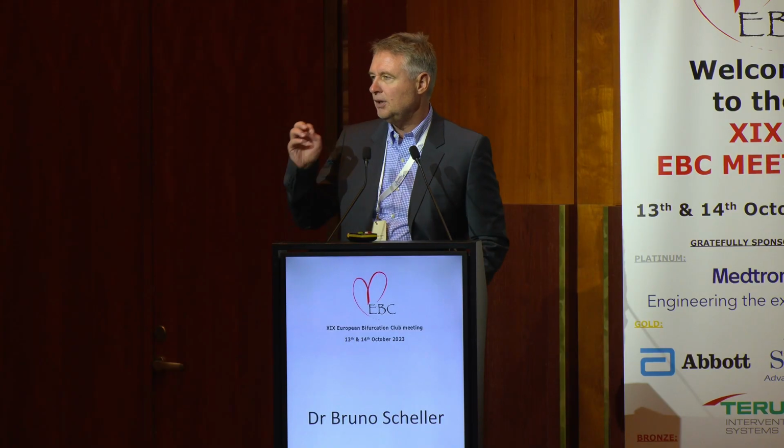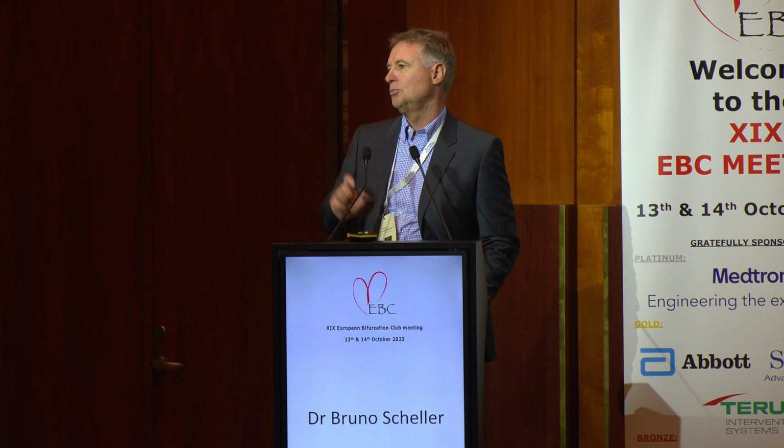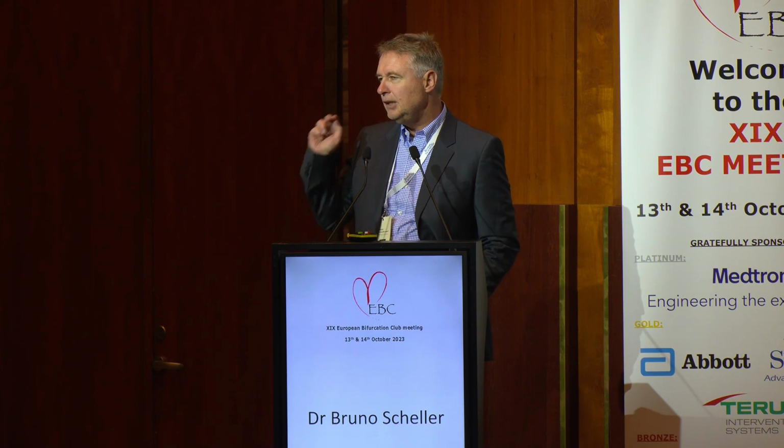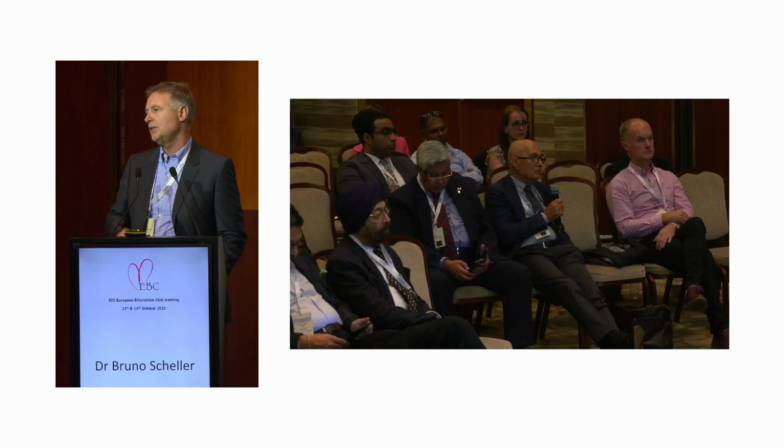But the point is, if you do not stent, you do not change the natural anatomy that way. And therefore, the need for kissing is much less frequent than if you stent in bifurcations.